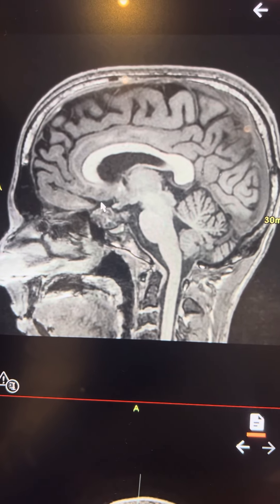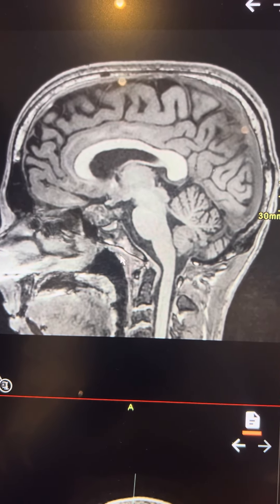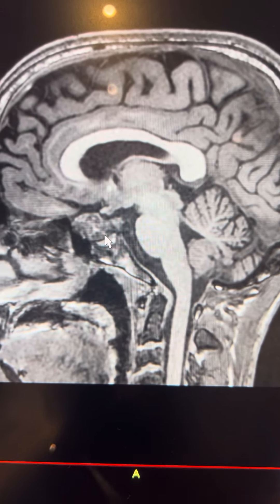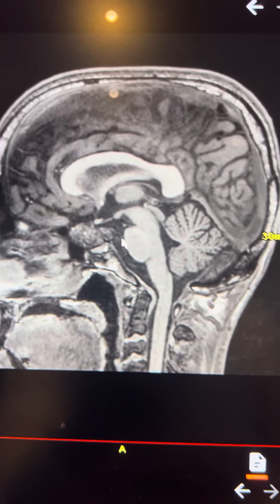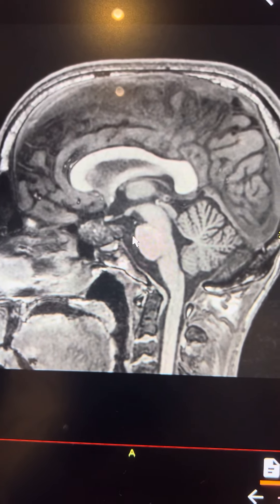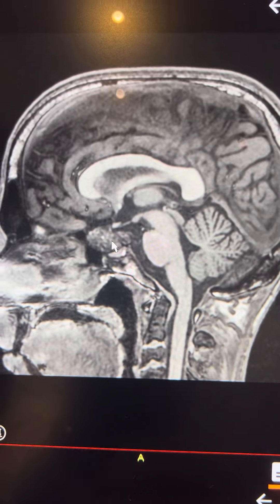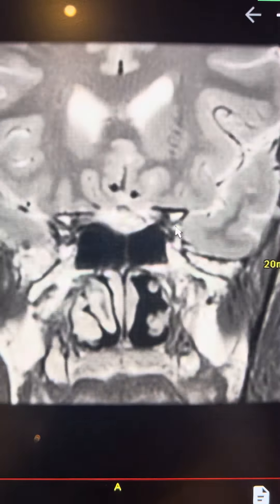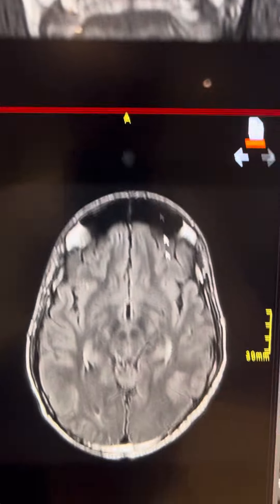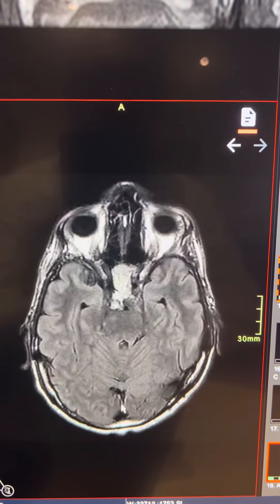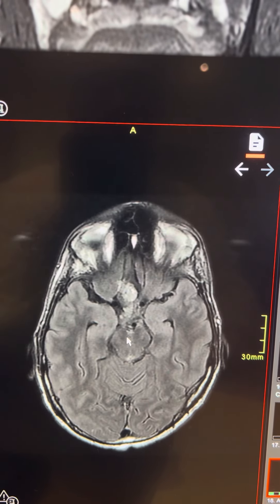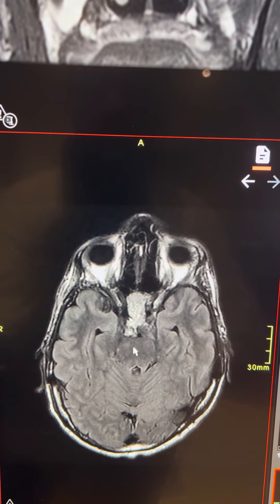You can see that there is an abnormal mass which is in the suprasellar cistern. It is separate from the normal pituitary, which is being pushed away, and it has heterogeneous signal on T1 without contrast and has some tiny areas of bright signal intensity. On T2 it is also bright signal, and on FLAIR we can see the extent of the tumor, how far it's going back, and also bright signal on T2.